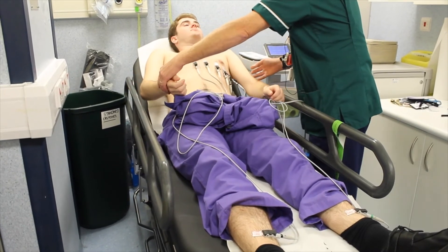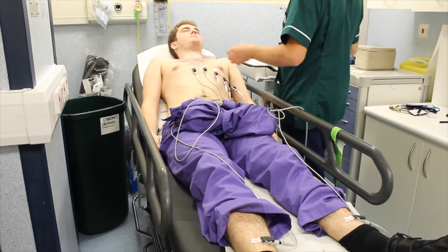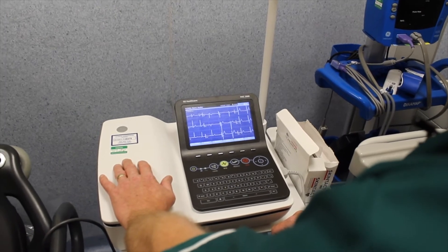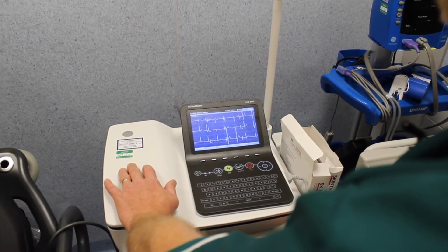What I need you to do now Jack is just lower your arms down, okay? Just stay nice and still and relax. Any movement will be detected on the ECG machine. That's looking fine.